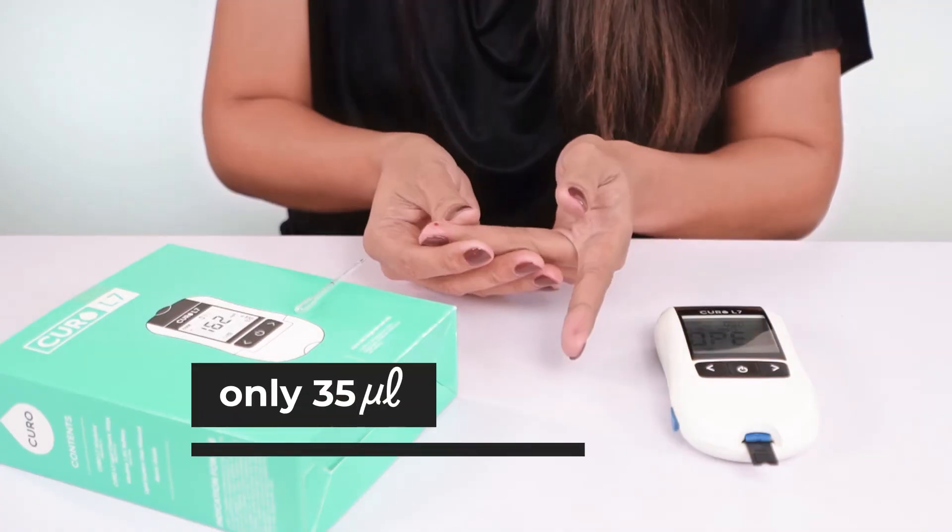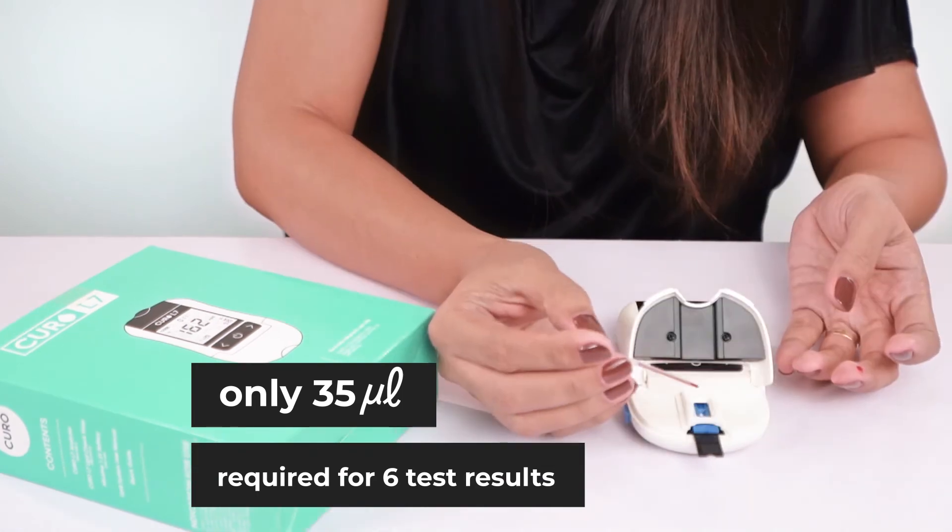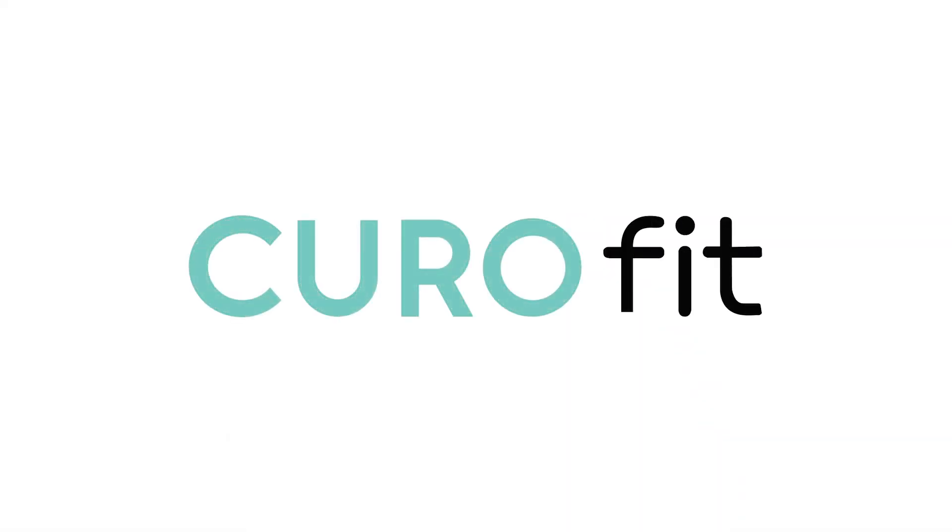Only a small amount of blood is required for six test results. Make healthy choices for your lifestyle. Choose Curo Fit and be a part of the innovation. Curo Fit — bringing life into healthcare.